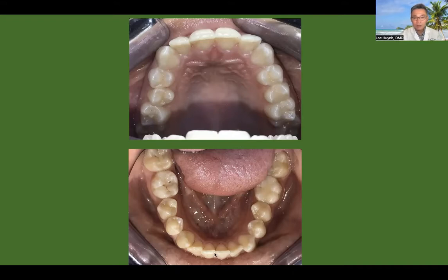Lower bottom teeth, same thing. You can see that numbers 24 and 25 are lingually inclined and super erupted. And these two, number 23 and 26, are distally rotated. This is rotated on the distal part facially, and lingually on the mesial part. Overall, and also the premolar right here, there's rotation right there. You can see rotation mesially of the buccal cusp.